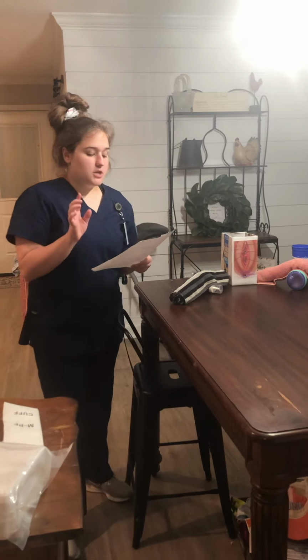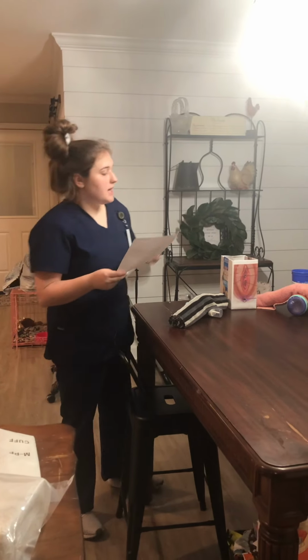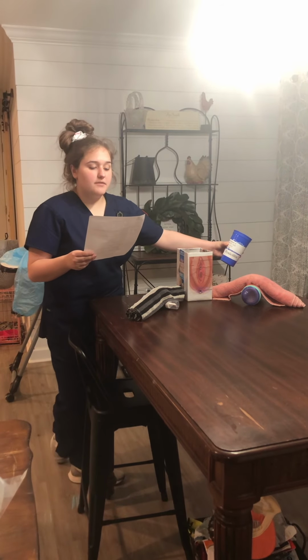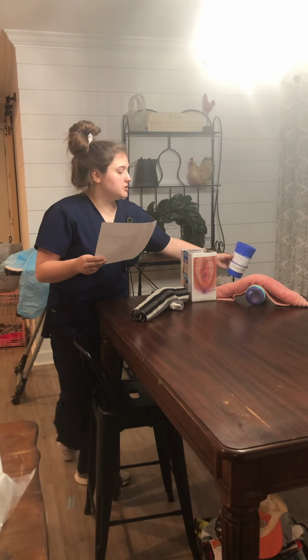So the first thing I'll do when I go into my patient's room is check my order and my policy, and then I'll perform hand hygiene. I'm going to check my identifiers. So I have Jaguar J. Jones, date of birth 08/25/1963, allergies penicillin.